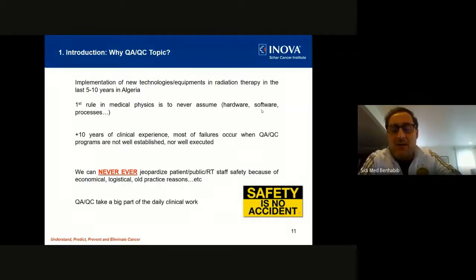And as you may know, in brachytherapy treatment, the dose is really high. So if one dose is delivered wrong, it's a medical event, a misadministration. So we have to be very, very careful, and we have to handle the pressure sometimes from radiation oncologists and the nursing team the right way. And the right way was to remove the patient from the table, do the QA, make sure everything went right, and then move forward with the treatment. And this is very, very important. We should never say, okay, yes, let's move with treatment, because it has never happened that the QA failed. Well, it fails on that specific time you decide to treat the patient without QA, and it's a million-dollar lawsuit.